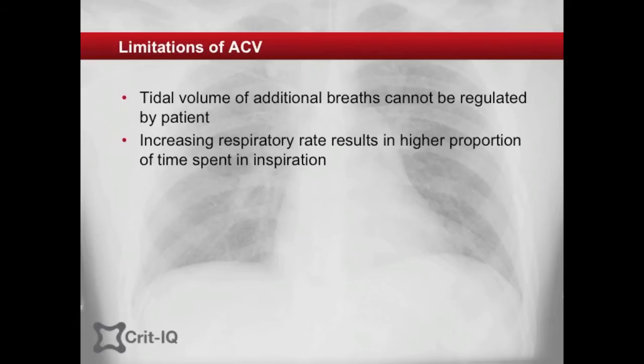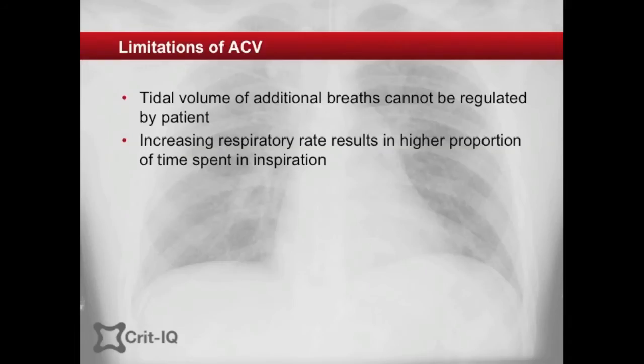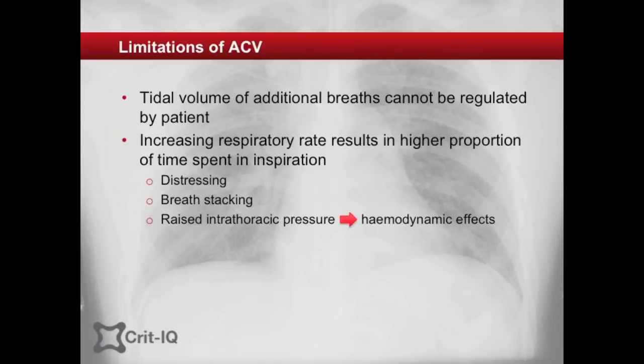Additionally, because the inspiratory time is fixed for both mandatory and spontaneous breaths, the proportion of the respiratory cycle spent in inspiration increases significantly as the respiratory rate increases. This can be distressing for the patient and can lead to breath stacking and raised intrathoracic pressures with hemodynamic consequences.